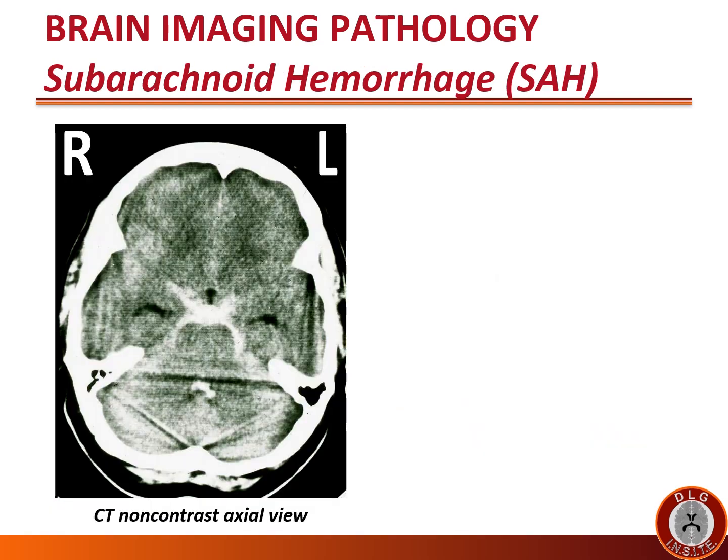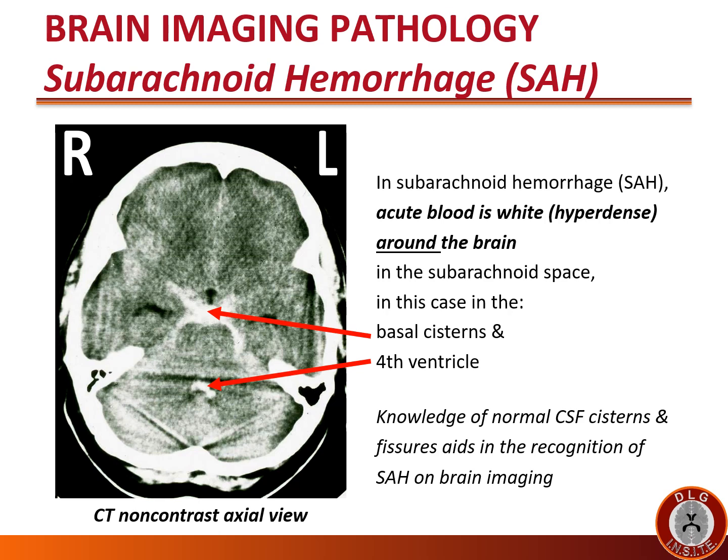Let's now look at bleeding around the brain — subarachnoid hemorrhage. In subarachnoid hemorrhage (SAH), acute blood is white and hyperdense around the brain in the subarachnoid space — in this case, in the basal cisterns and fourth ventricle. It is very important to have a knowledge of normal CSF, cistern, and fissure anatomy, as this aids in the recognition of subarachnoid hemorrhage on brain imaging.